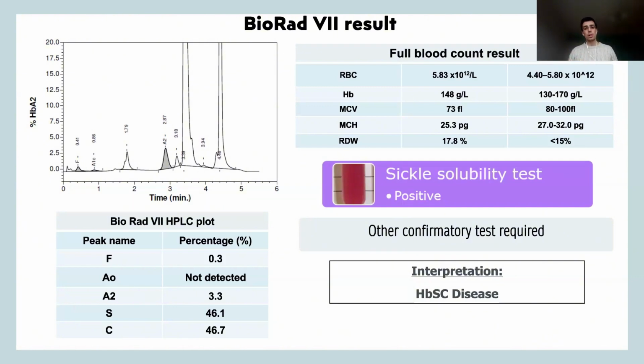In this case, hemoglobin C. You could use another technique, such as gel electrophoresis, alkaline will be sufficient, IEF, or mass spectrometry, depending on what settings you have. It needs to be a different principle from your screening method, so HPLC cannot be used as well.